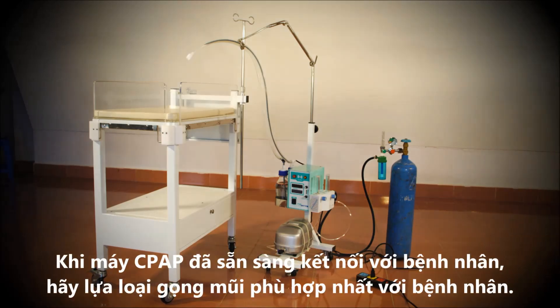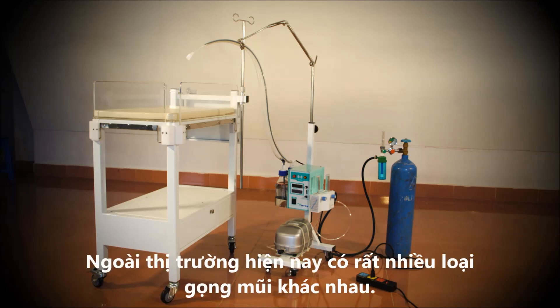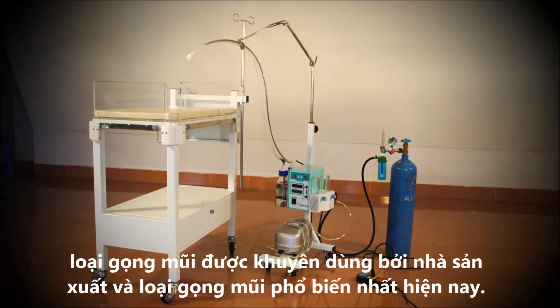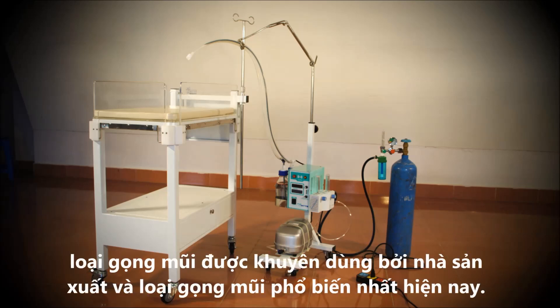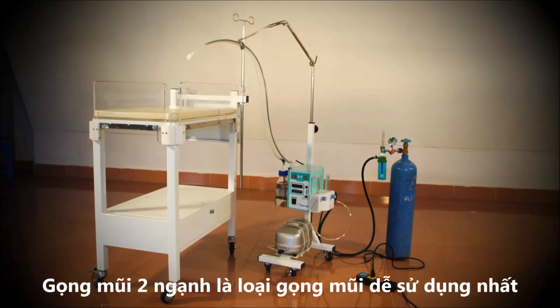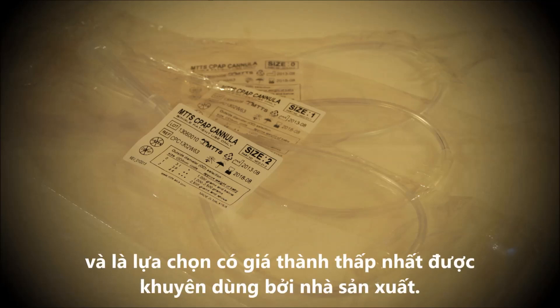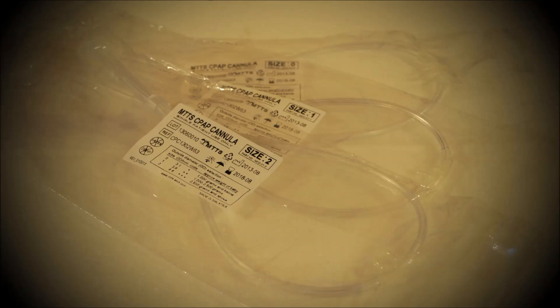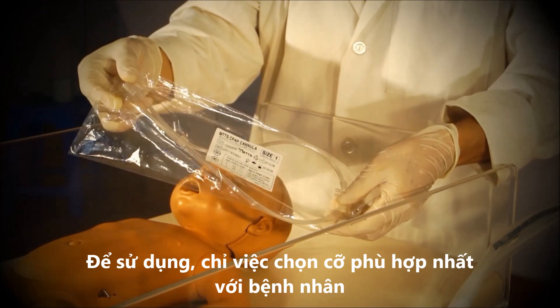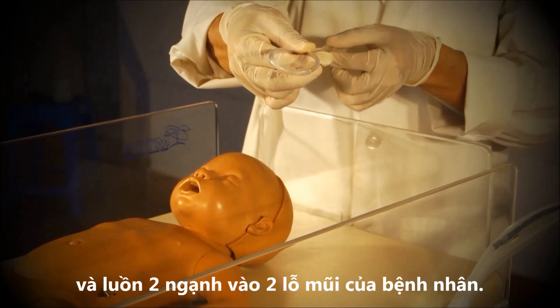When you are ready to connect the patient, select the appropriate cannula. There are several cannula options on the market. We will demonstrate use of two options: the cannula recommended by the manufacturer and the option that is most widely available. The dual nasal cannula is the easiest interface to use and an inexpensive solution recommended by the manufacturer. It comes in three sizes. Select the appropriate size for your patient and simply insert the nasal prongs into the patient's nostrils.